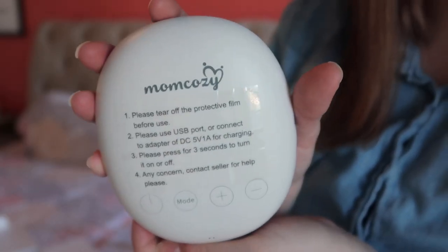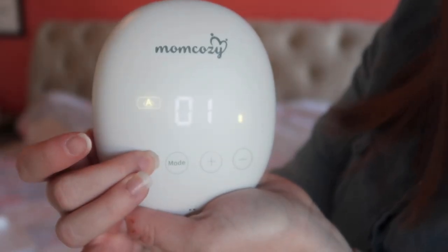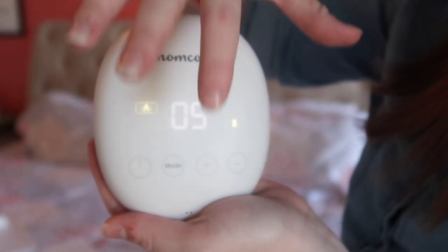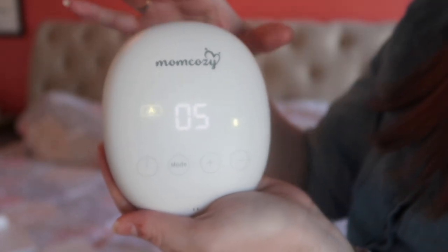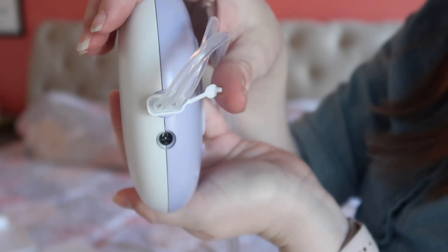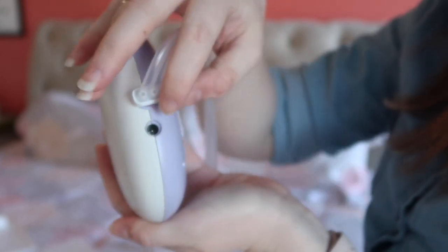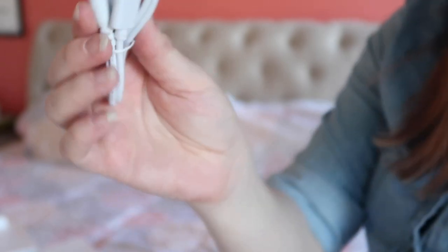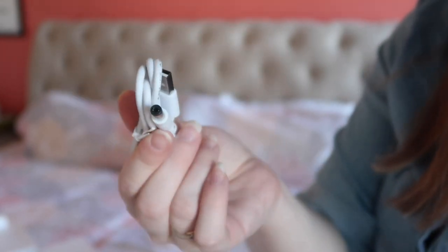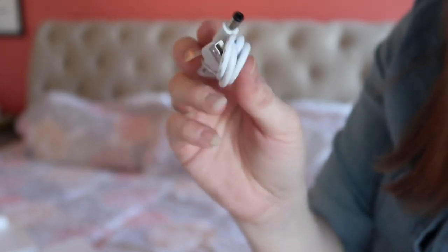Right out of the box you can turn it on — it comes charged. Here's the actual pump. On the side is where you plug in the tubing and also where you charge it. This is the cable that came with it, so you just need a charger block, which most everyone has.